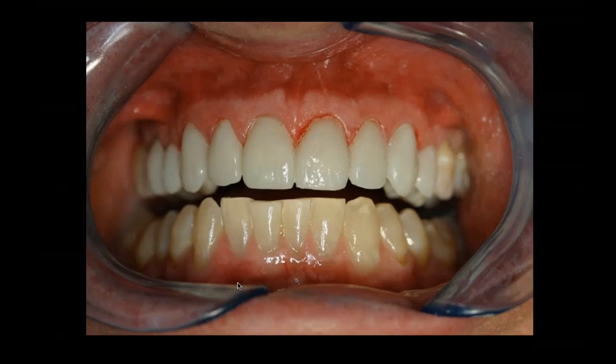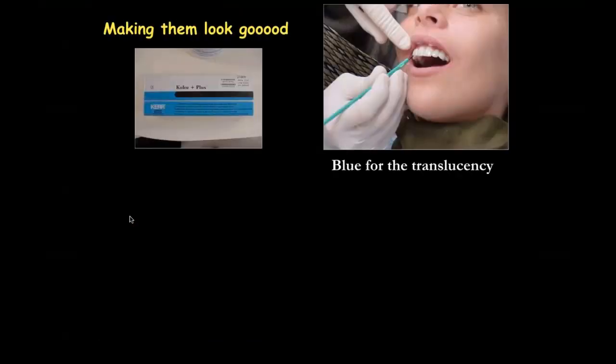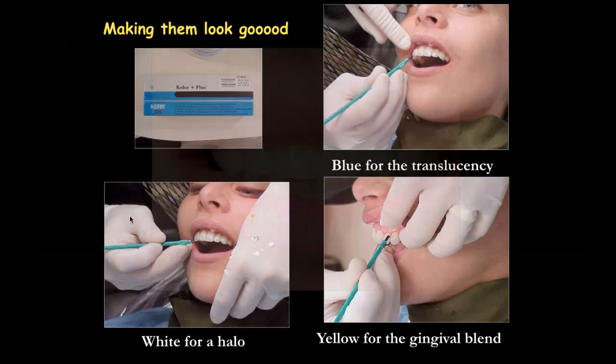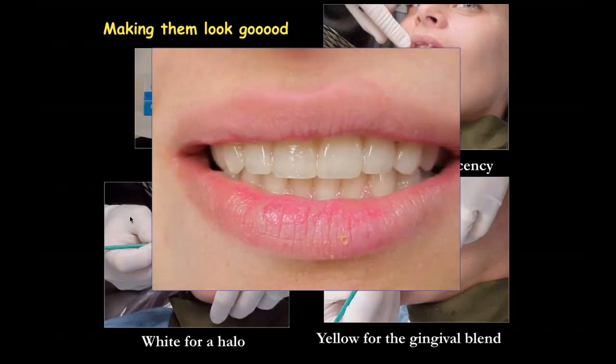Now, I don't cement these temporaries. These temporaries are locked on there, and they stay right on there. And sometimes you can get real fancy with it. You can use glaze, we use Color Plus. Here you can see blue for some translucency on the temporary. You use white for halo, yellow for ochre around the gingiva, and it comes out pretty nice. So a lot of times patients will say, can I just keep these?